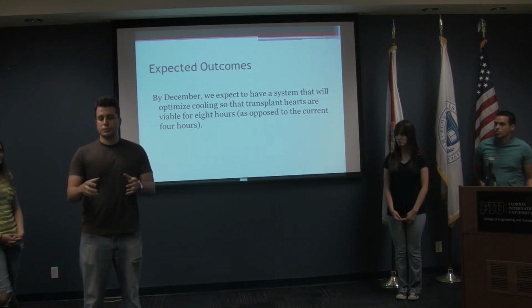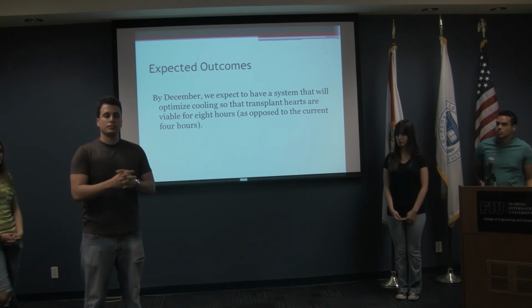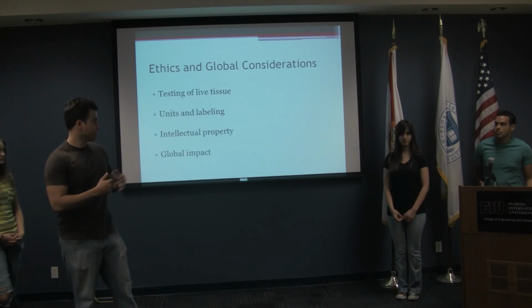There will be differences because of the physical plastic model; you're going to have more deformation than in the CAD model, but if we can see the same trends, we can make accurate predictions as to how it will behave.